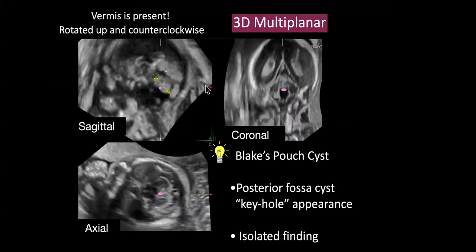And we did 3D imaging to really look at the vermis. We actually measure the vermis as well, and there are nomograms out there to see if it should be consistent within gestational age. And we did see that the vermis is present, and that is key, right? Whether or not the vermis is present. And here you could see that the vermis is actually present, but it's rotated up and counterclockwise.